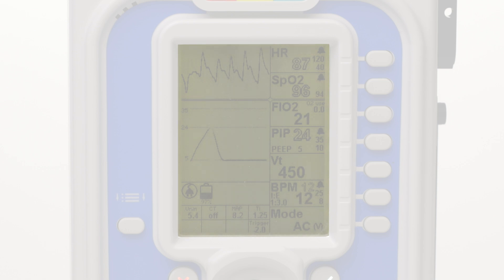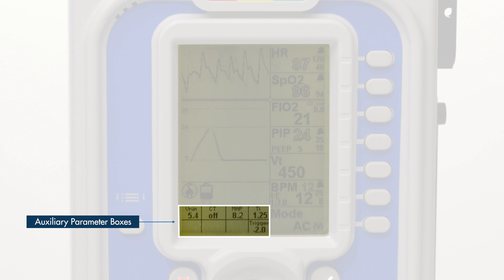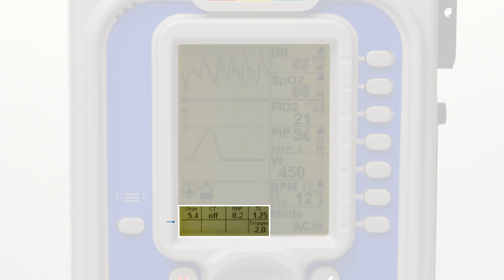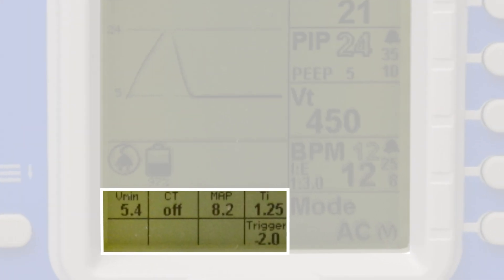Below the icon tray are the auxiliary parameter boxes. Some parameters have secondary values which the ventilator displays in these boxes, such as minute volume, mean airway pressure, total breaths per minute, and inspiration time. These settings can be adjusted from the parameter context menus.